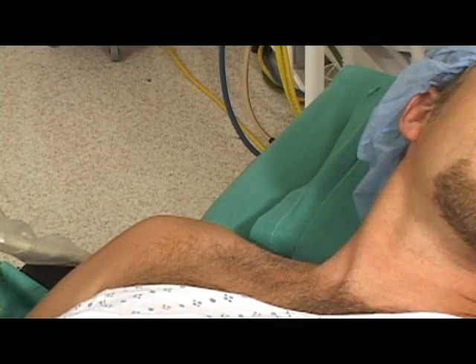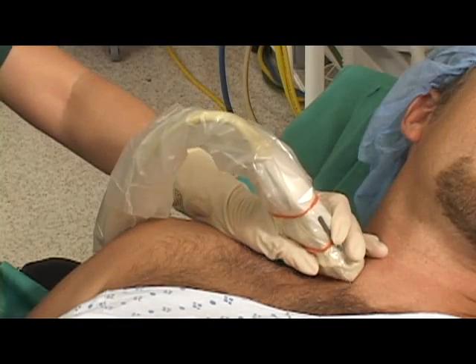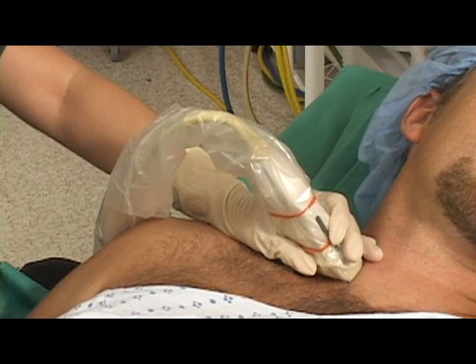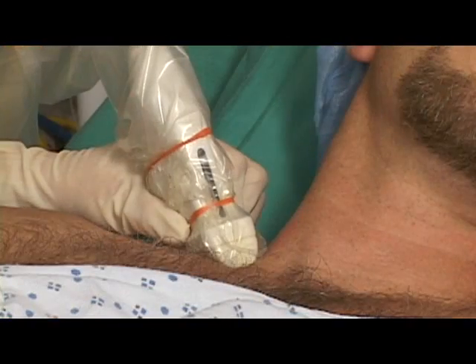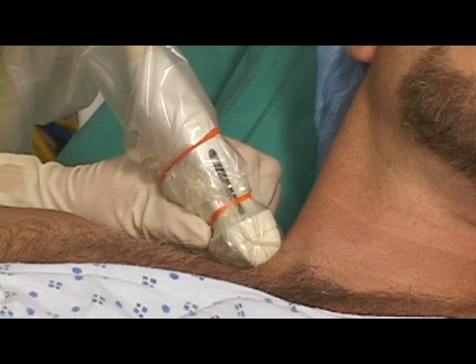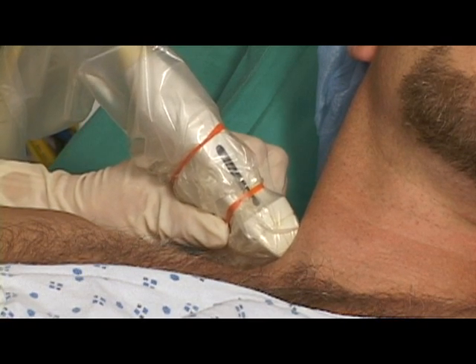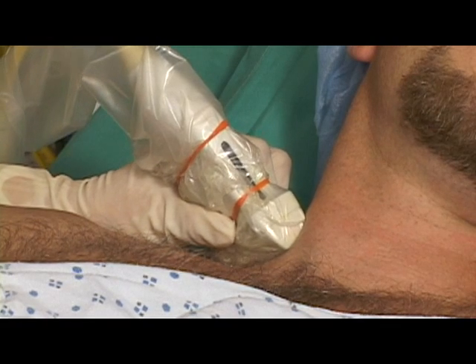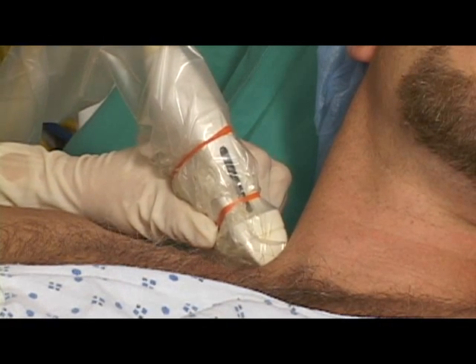The patient is placed in supine position with the head turned to the opposite side. The head of the bed is slightly elevated to help the patient's shoulder relax and bring the planes of display and imaging into closer alignment with each other.